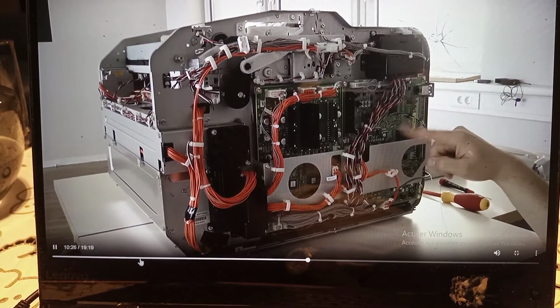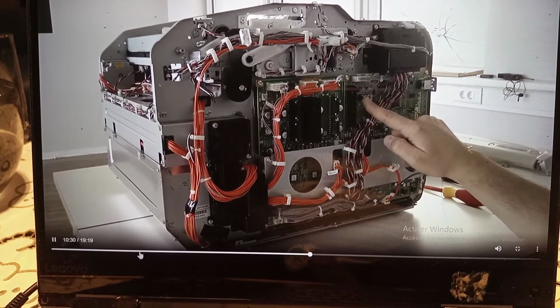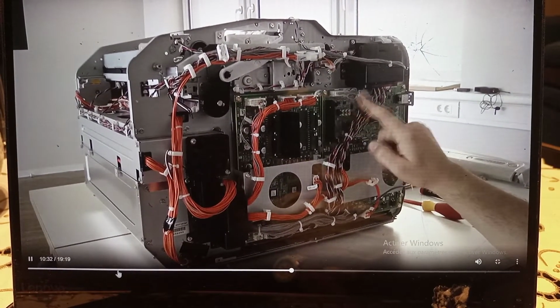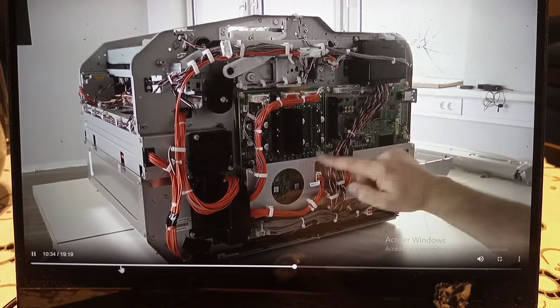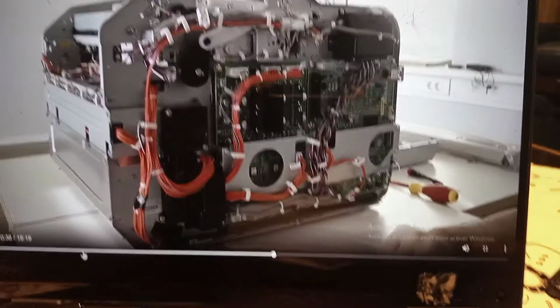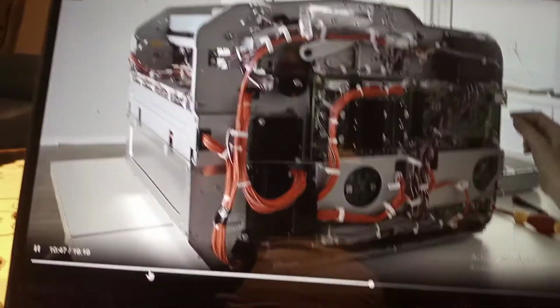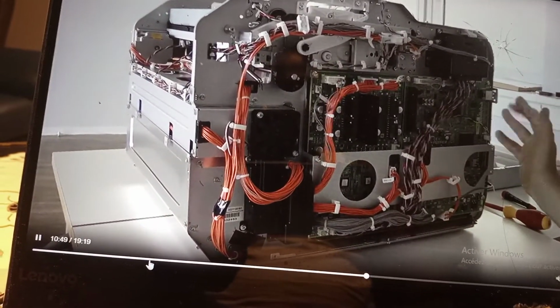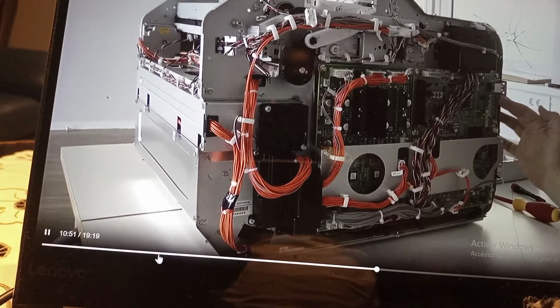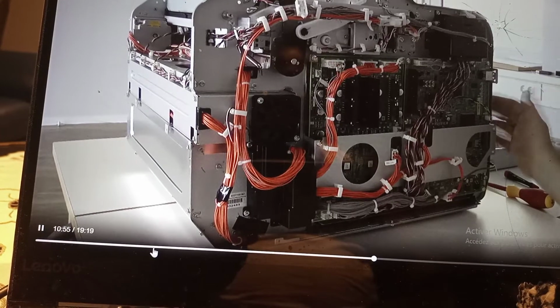Also, on both of them we have some fuses, so in case of a blown fuse, many of them are on one of these boards, like for example these 3 here on top. We have also some LEDs named LED number 1 till 15. This will show red and green lights depending on the status of the device or an error code of, for example, a sensor.